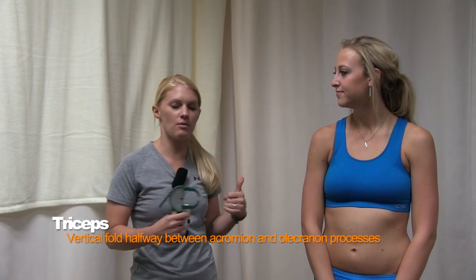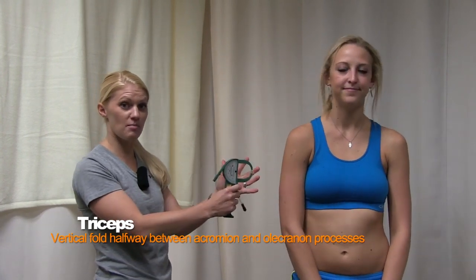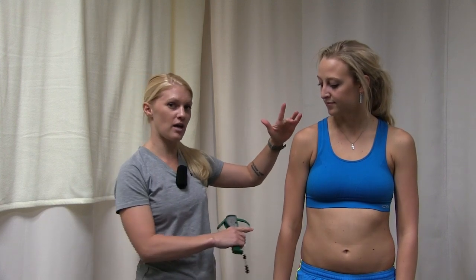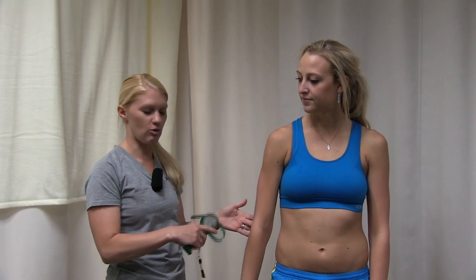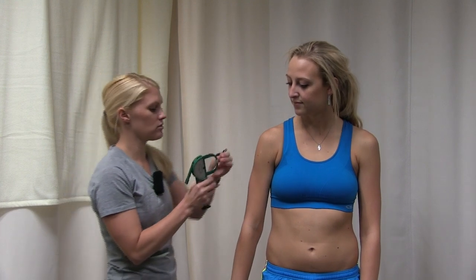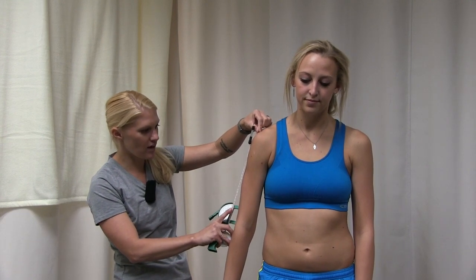The first measurement is the tricep. All measurements are going to be on the right side of the subject's body — always use the subject's right side, not yours, because if they face toward you versus away it will change. For the tricep, we use a measuring tape. The location is halfway between the acromion and the olecranon process — basically the end of the shoulder and the elbow — so I'm going to measure from the top of the shoulder to the elbow and find the halfway point.